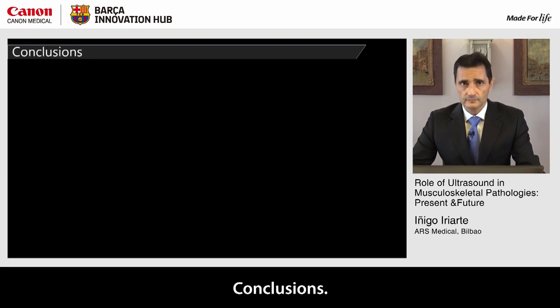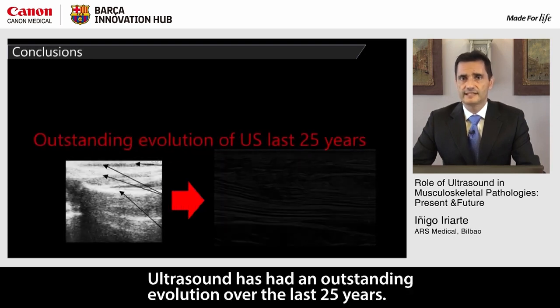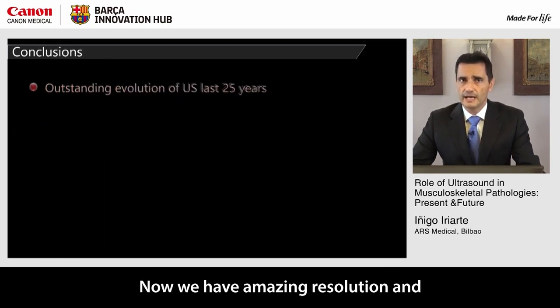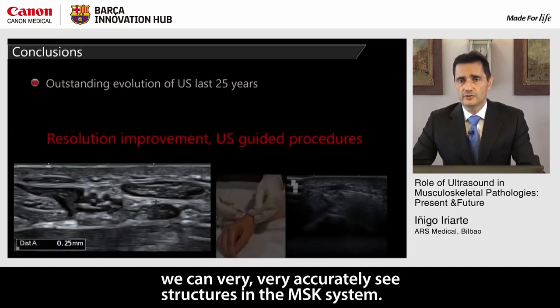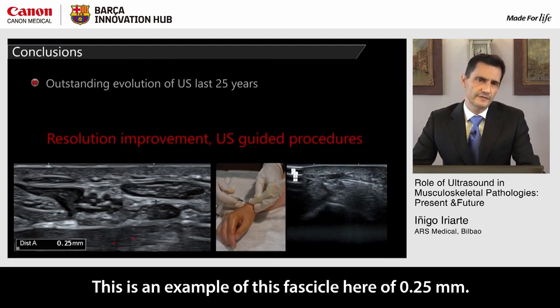Conclusions. Ultrasound has had an outstanding evolution in the last 25 years. Now we have an amazing resolution and we can see structures in the MSK system very accurately. This is an example of this fascicle here of 0.25 millimeters. Okay?